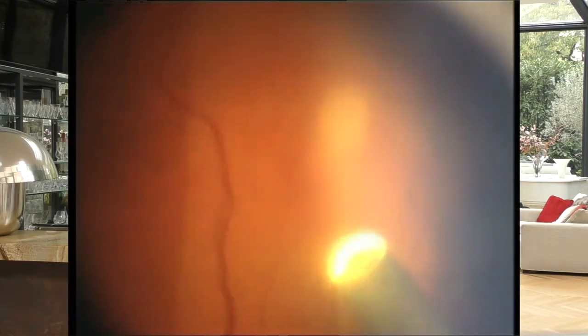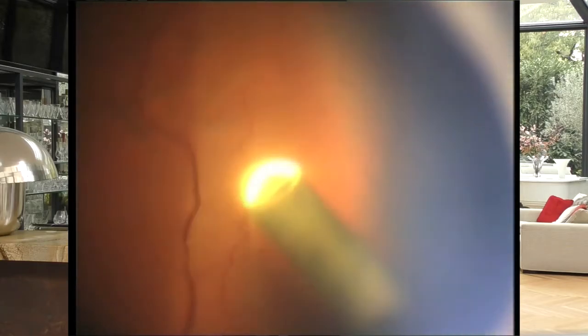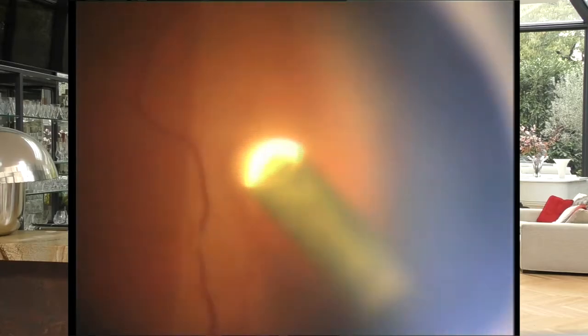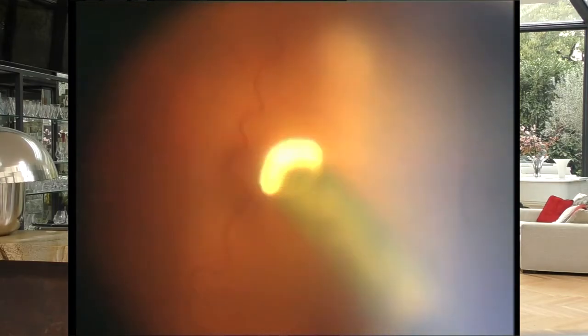Here is what I already presented more than 20 years ago. Here I'm cutting at 600 cuts per minute. The retina moves because the adherent vitreous has the time to come in the port. Now I'm using 1,800 cuts per minute, and a miracle occurs, for the retina no longer moves, giving the operator the illusion of having finished an excellent vitrectomy.